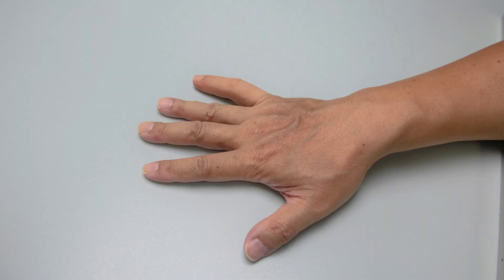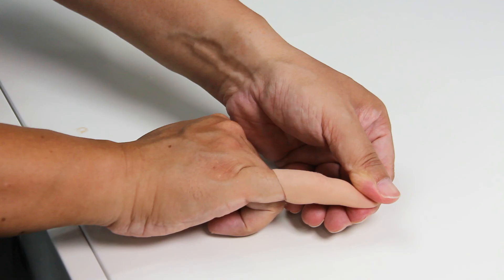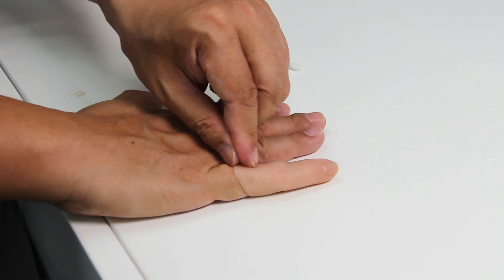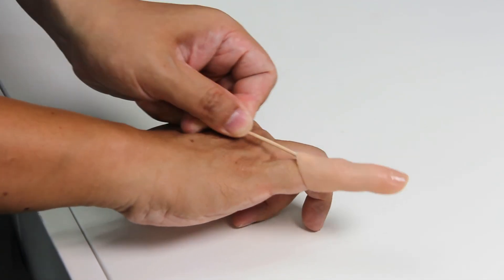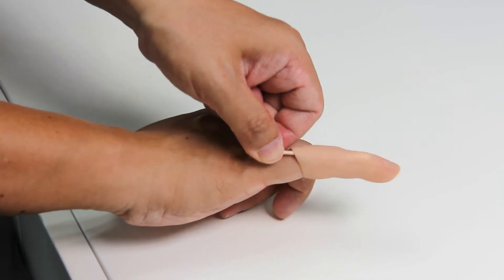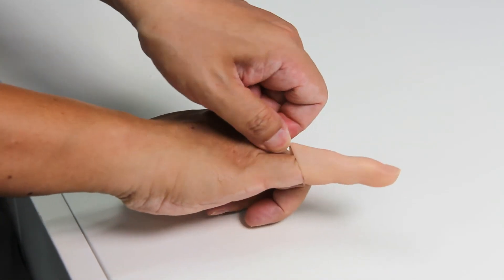When wearing a silicone finger, the air inside will be squeezed out, creating a vacuum effect. This helps the prosthesis to secure and stick to the stump, meaning suspension will be good. While taking off the finger, do not pull the finger directly or scratch the edge, as these actions can cause a split from the side or the opening. Instead, use a cotton pin inserted into the opening to let air in and then try to take off the prosthesis.